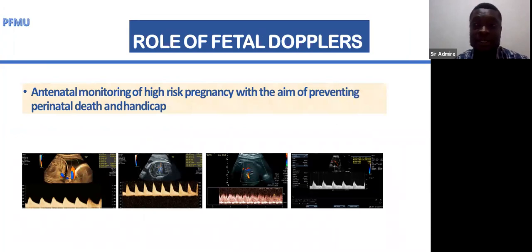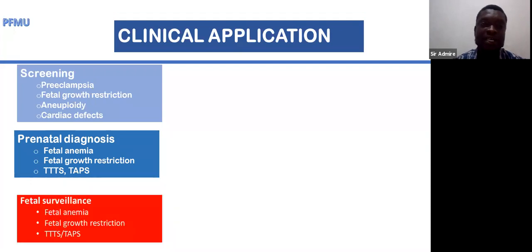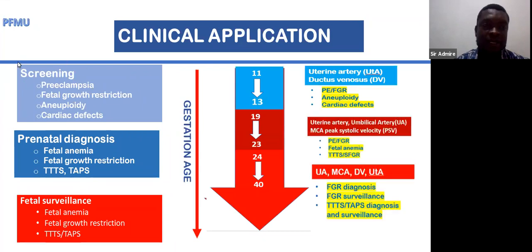I think you saw our statistics there on the high side, which is something which our fetal medicine units, as well as everywhere you are, you should play a role in trying to make sure that those statistics don't remain that high. So Dopplers play a variety of roles, though today I'll be mainly focusing on preeclampsia and fetal growth restriction, but they play an important role during the course of pregnancy. The Dopplers can be used in screening for preeclampsia, as well as fetal growth restriction in early pregnancy. When we do the 11 to 13 week early pregnancy scan, we can also do the uterine Dopplers in order to predict the risk of that pregnant woman developing preeclampsia later on in pregnancy.